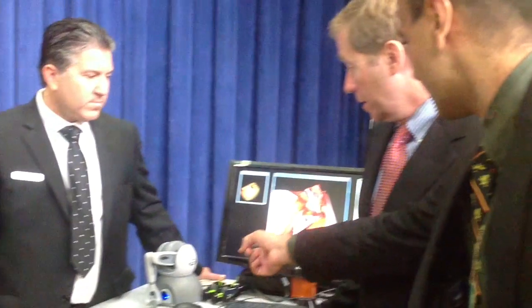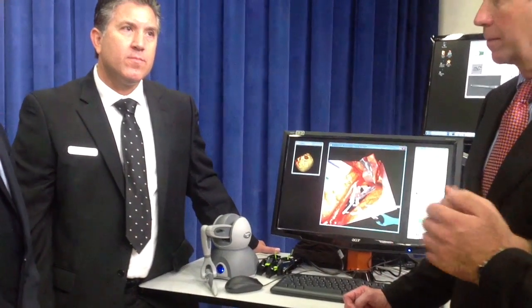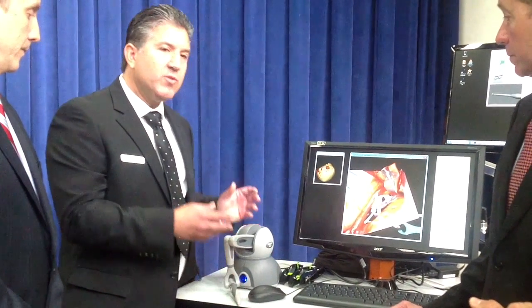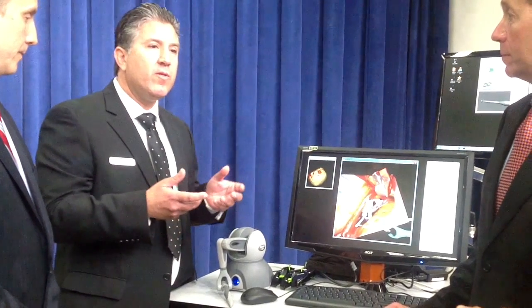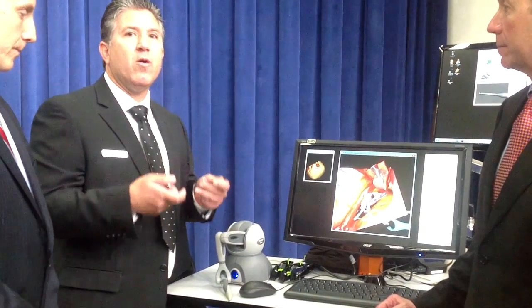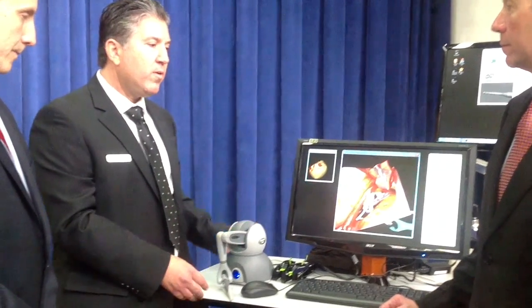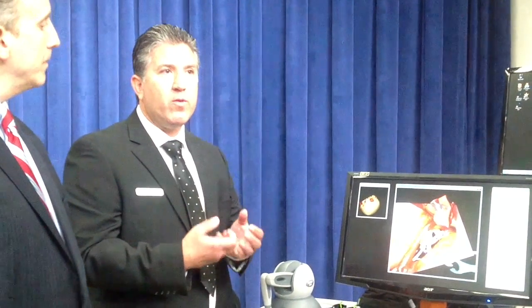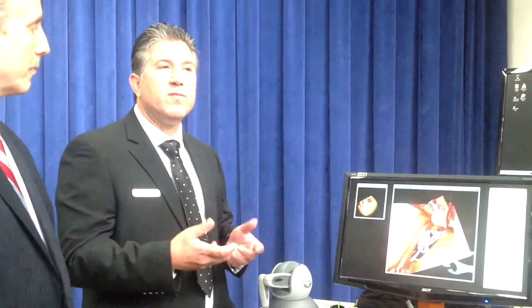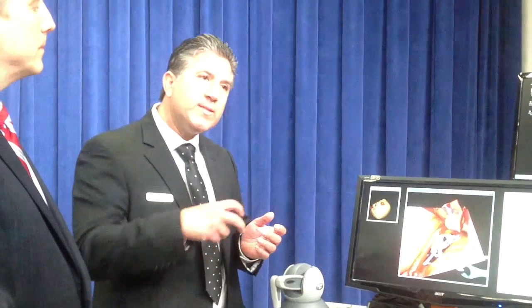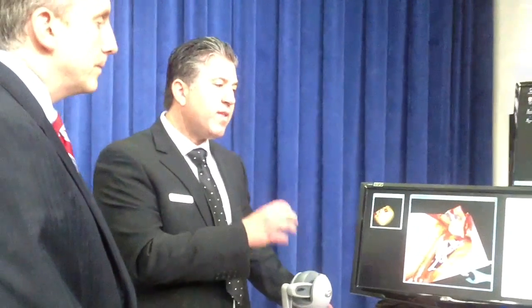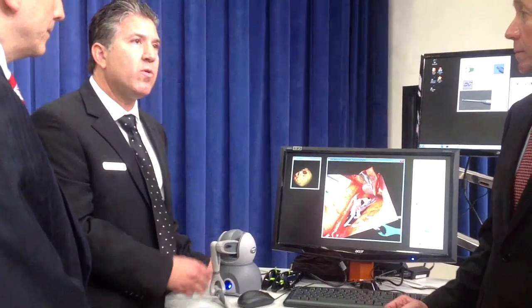Commenting on the Phantom Omni system you're using to actually manipulate — we were guided by Dr. Ron Selman. He wanted the devices to be as immersive as possible. He really wanted to close his eyes and truly not be able to tell the difference between being in the OR or doing the operation here. So we chose the SensAble Omni because they provide, on one hand, haptic feedback back to the hand so you can feel the vessel, and on the other hand, it's intuitive. So when someone operates, the muscle memory kicks in — you do it once, twice, and you know exactly the maneuver you want to do. We really invested a lot of time and effort to choose the perfect interface for the surgeon to work with the system.